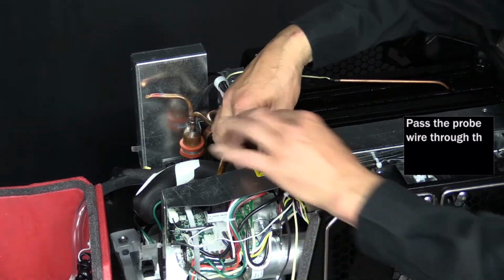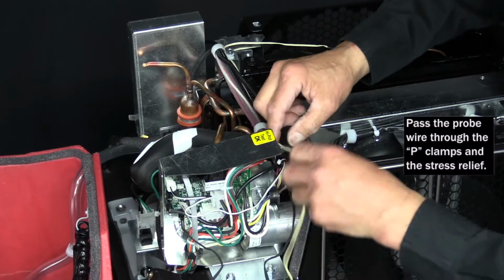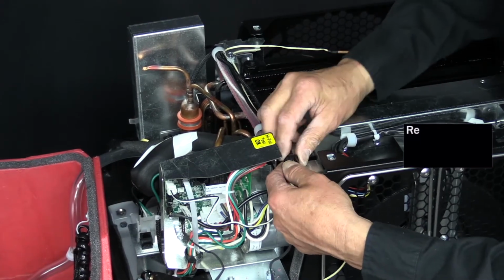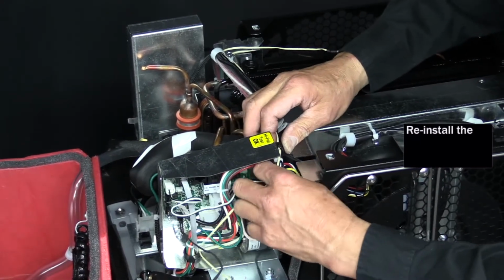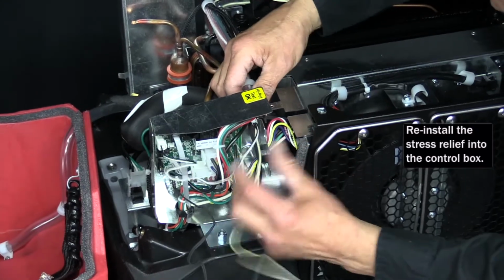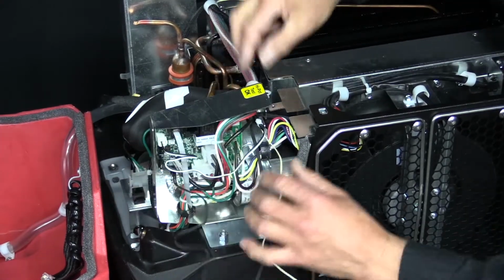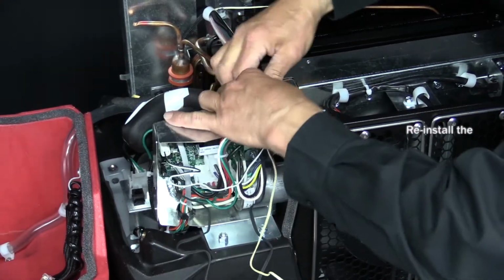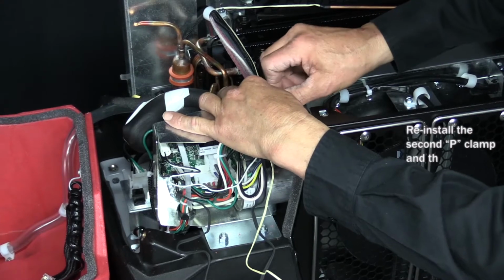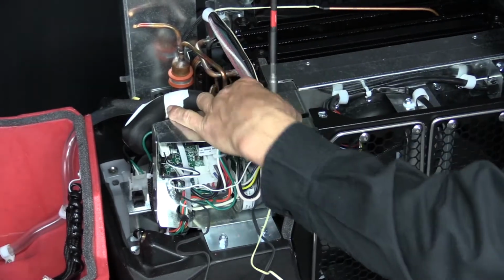And then next we'll pass the probe wire into the second P-clamp and then into the stress relief. And then reinstall the stress relief into the control box. Once you have that done, go and reinstall the second P-clamp. And once you get those started, tighten them up.